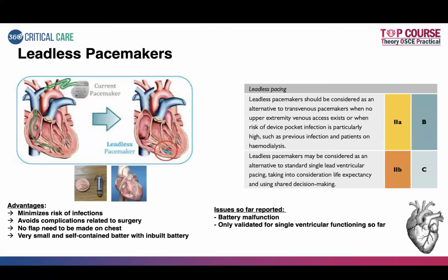So this was the last slide, and this is an important slide which I thought I should keep, because in the DNB exams, invariably they're asking bouncers. So this is one of the potential bouncers that can be asked, because leadless pacemakers are now slowly coming up in a big way. It does not need any specific leads and all.